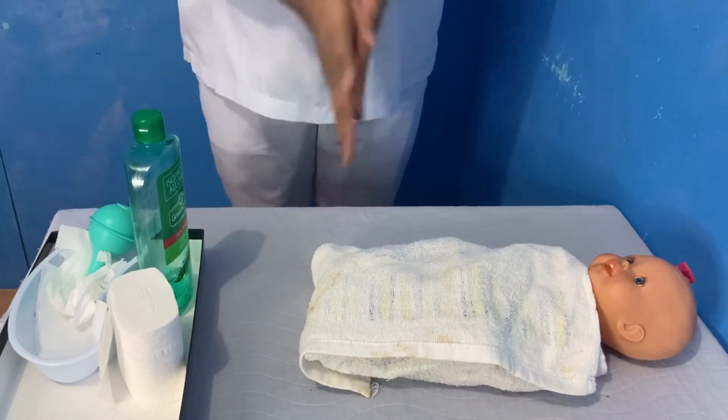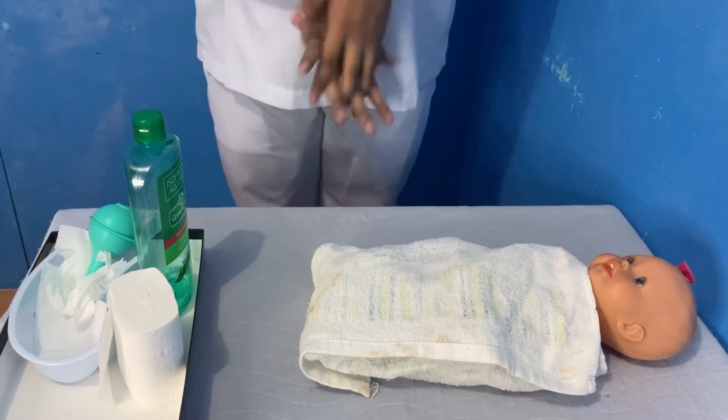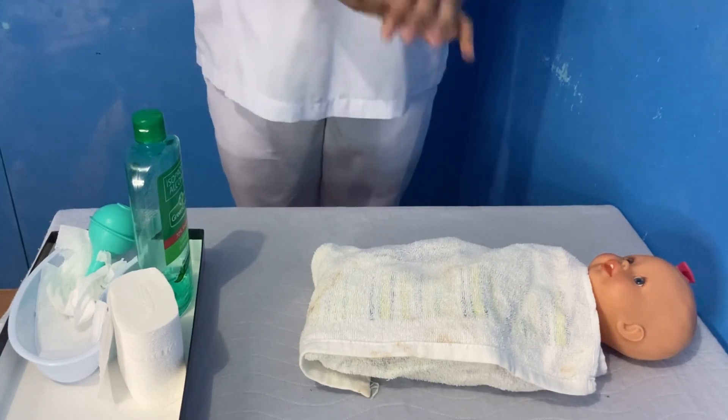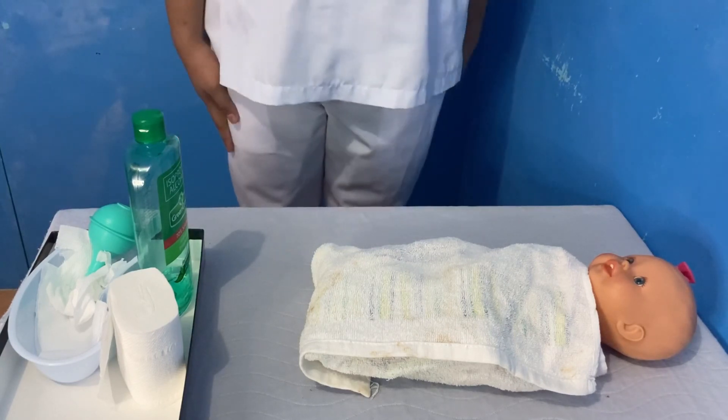Reassess the newborn's lungs and provide reassurance and comforting to the parents and newborn. Document the procedure and any abnormal findings in the client's chart. Thank you.